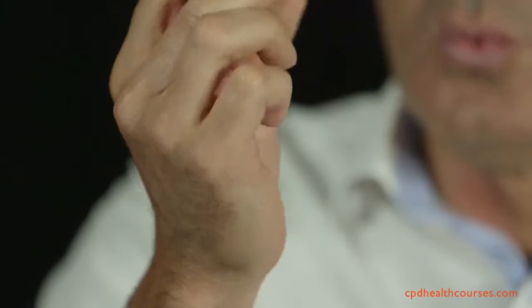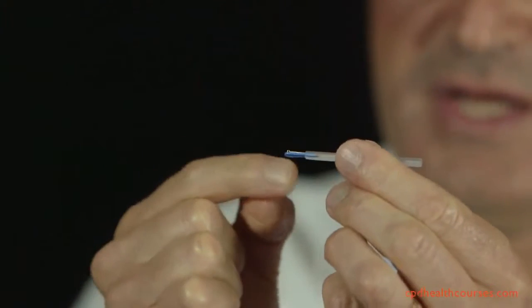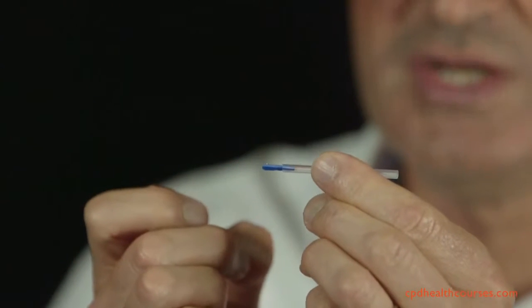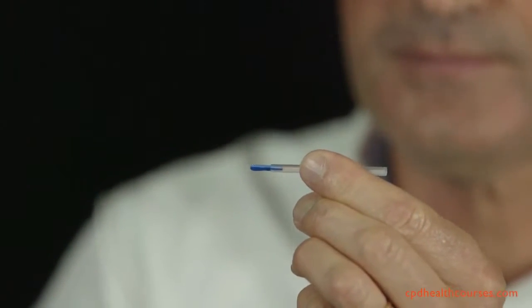So what you've got in here is a guide tube and the needle and the tab. The tab retains the acupuncture needle in the guide tube. To remove this tab means that you'll be ready to use the needle. So how do we do that? Well, there's 2 ways you can do that. One is a little cumbersome and probably a beginner way to do this, and it's not my preferred option, but I'll show you it anyway because it's a good way to start.